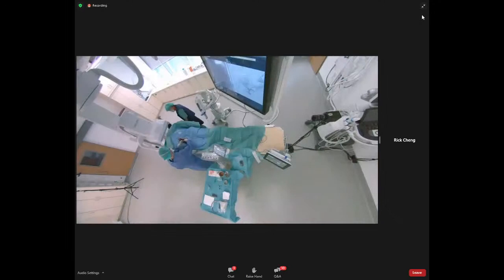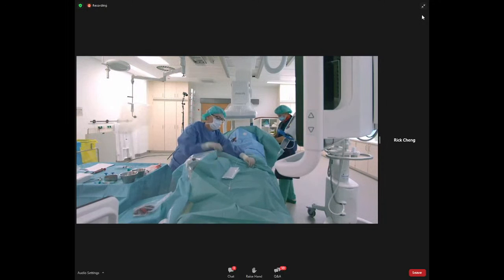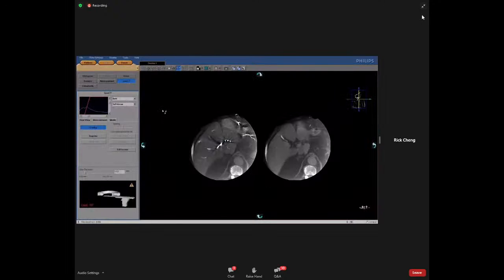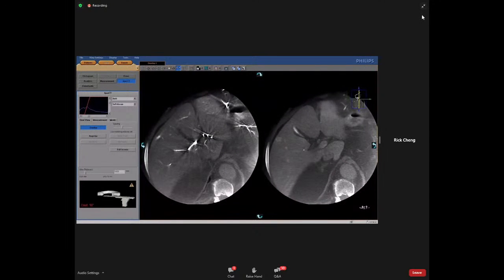After the cone beam CT dual acquisition, the patient's arms can be put next to the body for more comfort, and the injector is disconnected from the catheter. On the left, the arterial phase will be present, and on the right, the late phase will be present.